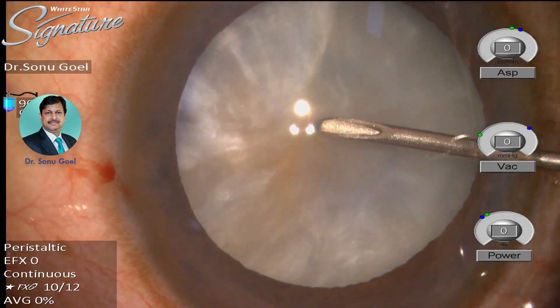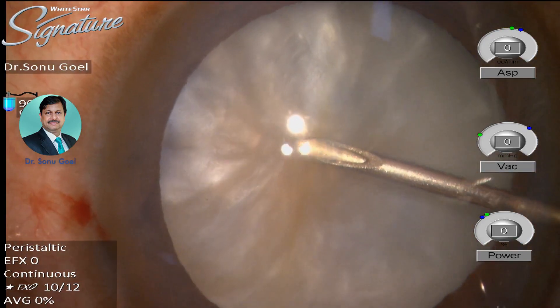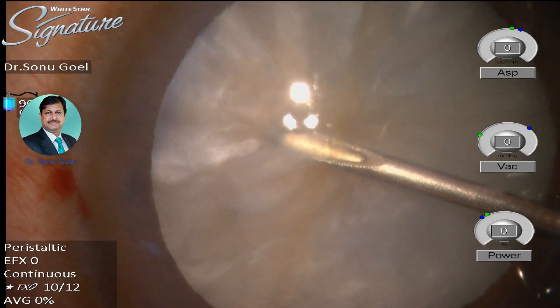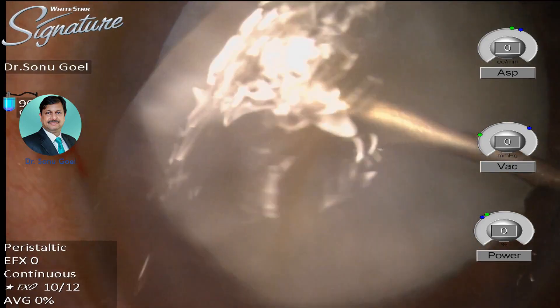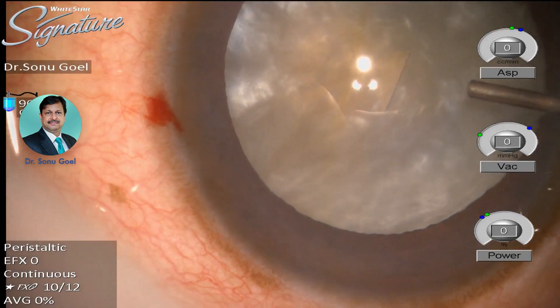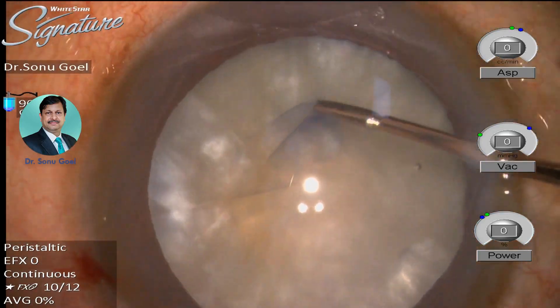A second situation is where, using a 26-gauge needle, we give a small nick, go inside underneath the anterior capsule, and gradually aspirate out the fluid. Care should be taken that the capsule should not be engaged in the vacuum so created, and we gradually aspirate, trying to decompress the high intralenticular pressure inside the bag. Once the fluid is out, the anterior capsule becomes flattened and can further be dampened by pushing in healon and using microrexis forceps through the side port. Once this is flattened, a good capsulorexis can then be fashioned to the desired size.